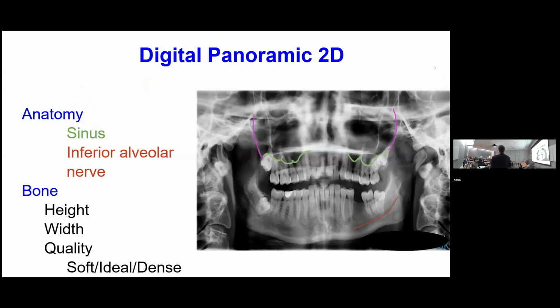So the first thing we were using CT scans for, and we've been using three-dimensional scanning since I began in the mid-90s, they were radiographs. We had these big view boxes, and we would take CT scans and put them up on the view box, and we had these calipers that we would measure with. It was crazy. And then we'd try to go from this measurement on a view box to the patient's mouth and figure out where the heck we were. So we were really using them to just look at the anatomy.